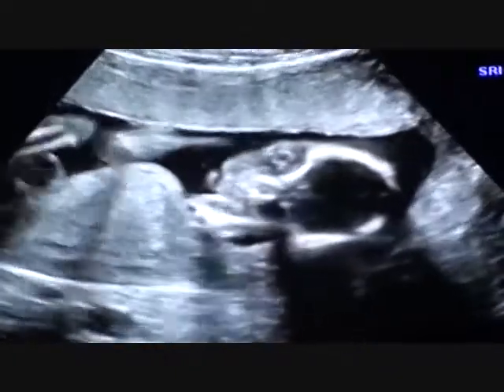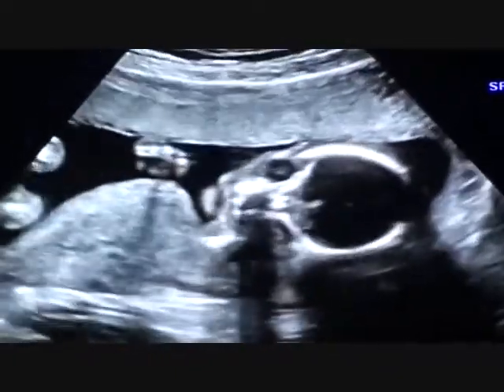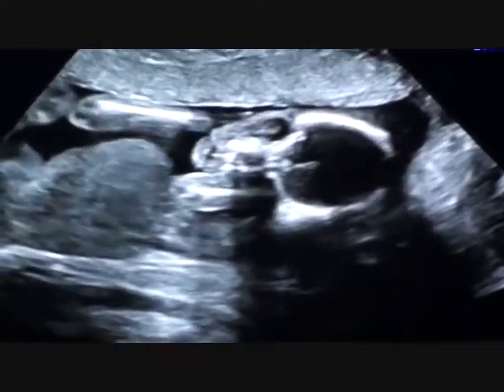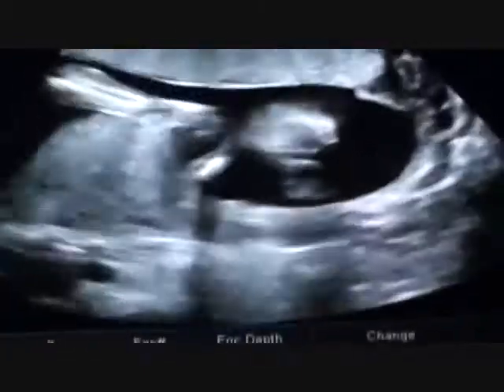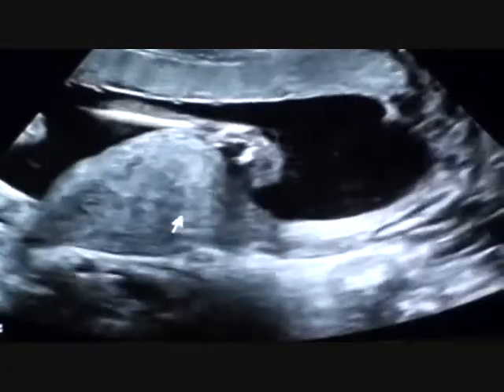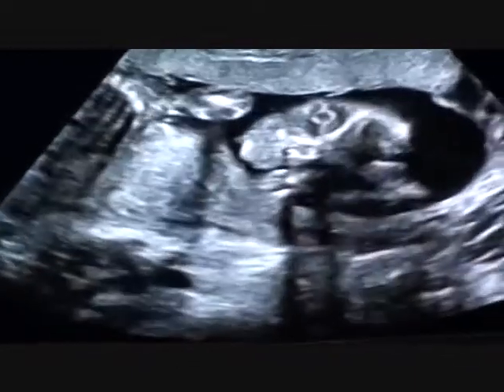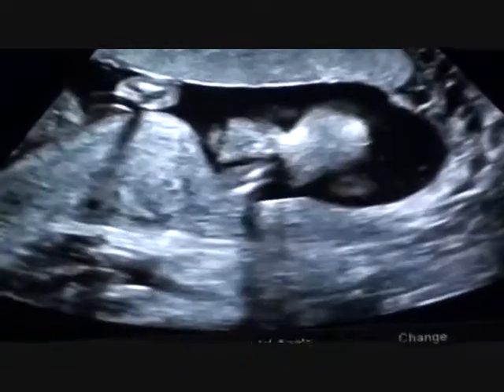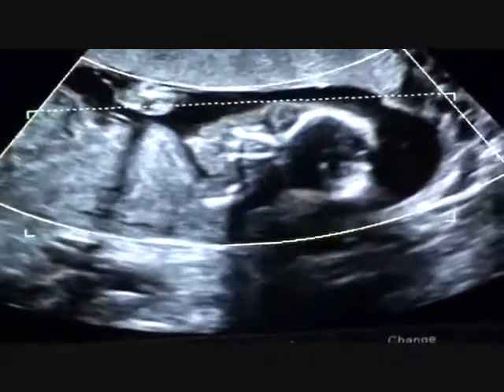So we'll wait for heart and bladder. Let's see if we can look at his face — it's kind of high down here. We're in a whole different position than we were a minute ago. Nice little face back there, little hands up there by the face. There's a little contraction back here — we're going to have a little Braxton Hicks. Tightness and pressure. Make sure you're drinking lots and lots of fluids. If you're any bit dehydrated it will bring on more of those than we want.